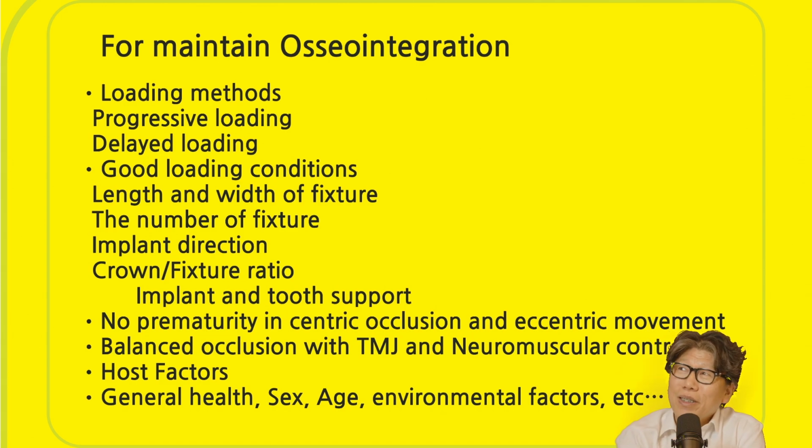So the secret is, number one, we didn't reduce the number of fixtures. I think the moment you reduce the number of fixtures, you've already compromised the longevity, the outcome of the treatment, the long-term prognosis. Then we use the longest, thickest ones that we can, and we place them in a good location and a good orientation. I think location and orientation is the most important thing.